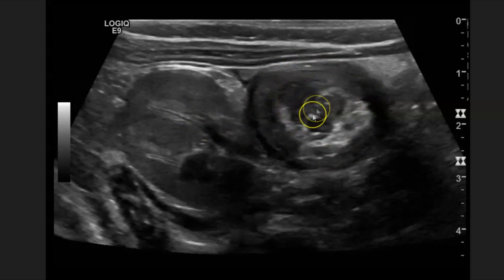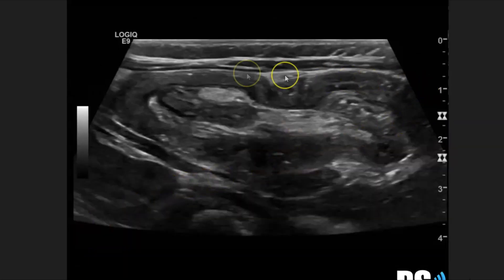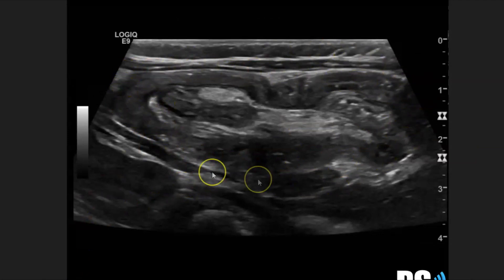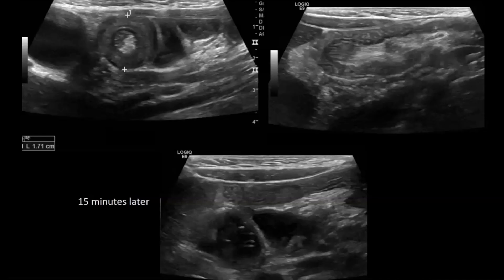This is the ileum wall, with a little bit of lymph nodes and mesenteric fat. In sagittal, it's going to show the pseudo kidney sign. Here's a sagittal or longitudinal view showing the pseudo kidney sign, because it kind of looks like a kidney with the hypoechoic cortex and the hyperechoic sinus. If you suspect small bowel intussusception due to location or size, give it some time and they should resolve on their own. If they're ileocolic, those don't usually resolve on their own and they require intervention like an air enema.